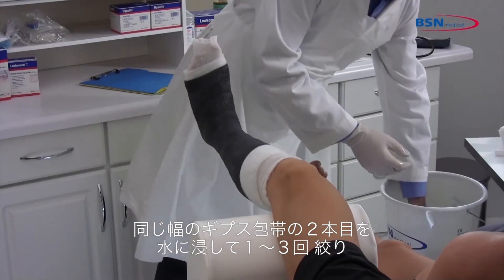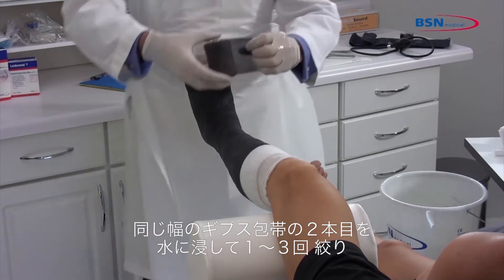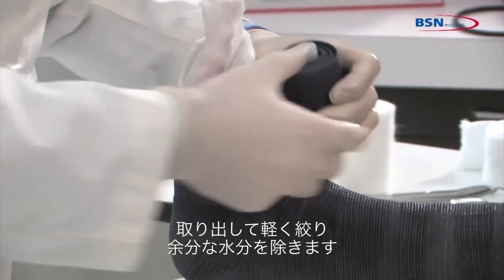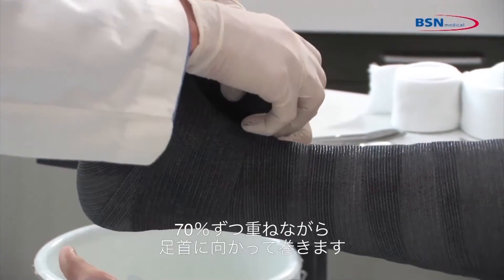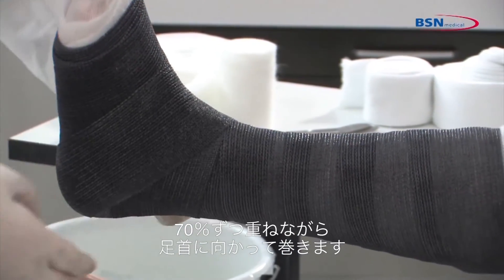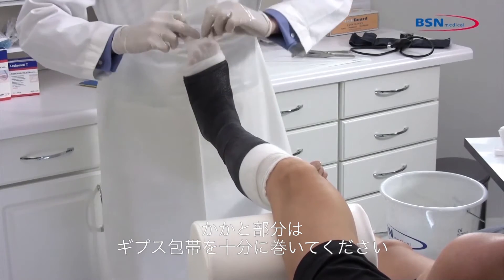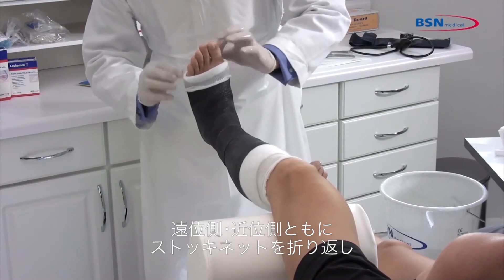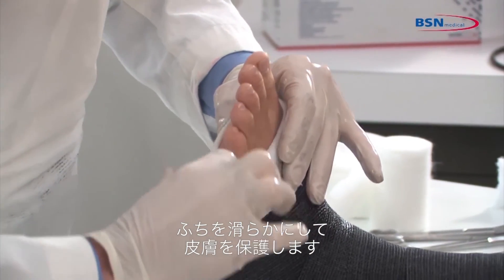Take a second roll of the same size cast tape and dip it in water, squeezing 1 to 3 times. Remove from water and squeeze 1 time to remove excess water. Start wrapping the cast at the metatarsals twice and work toward the ankle with 70% overlap. Go around the ankle and lock in the talus. Be sure to have sufficient layers of cast tape in the heel area. Fold back the stockinette at distal and proximal ends for protection of the skin and to create a soft end.